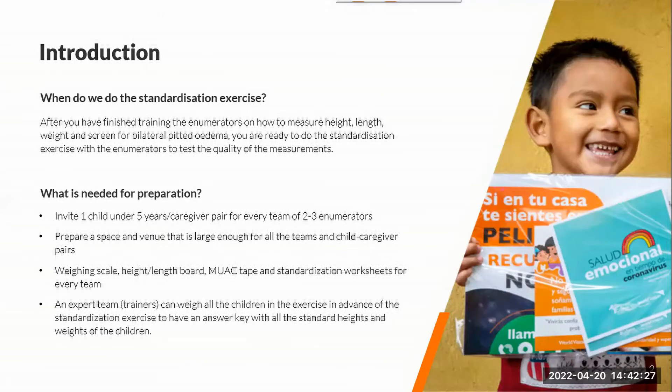Every team should have their equipment: a weighing scale, height/length board, and MUAC tape if you're doing MUAC. And then also the worksheets for every team.